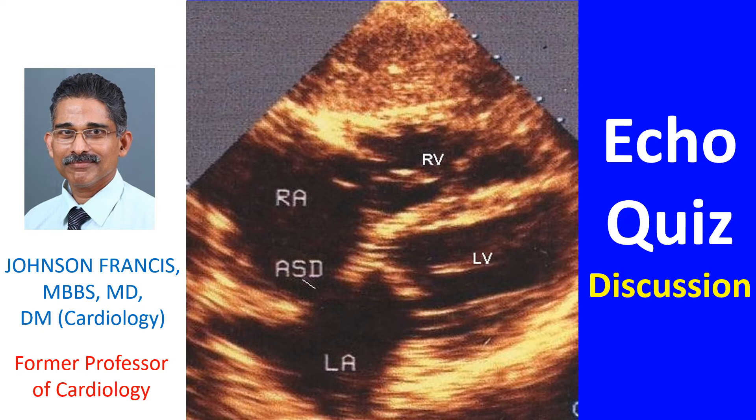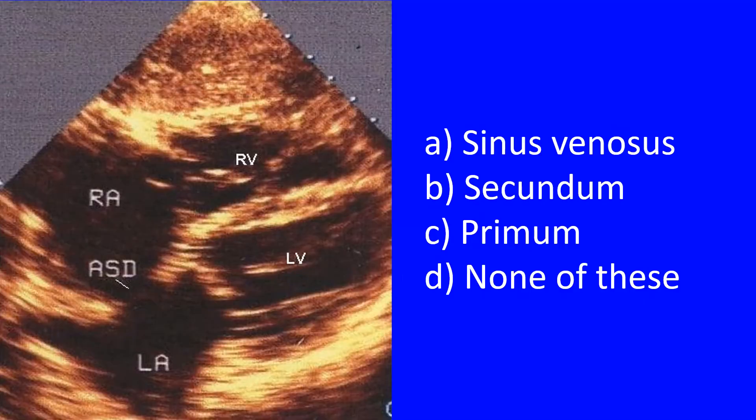What is the type of atrial septal defect seen in this echo? A. Sinus venosus. B. Secundum. C. Primum. D. None of these.